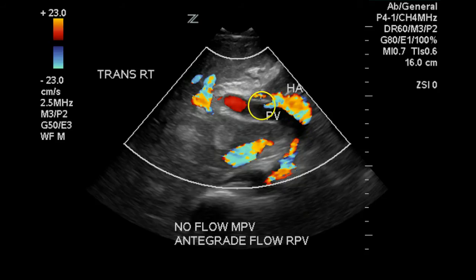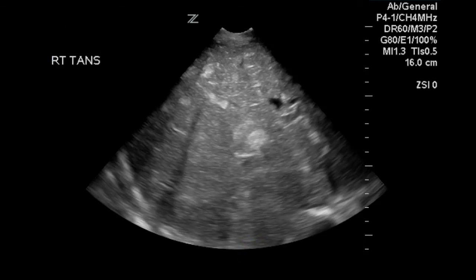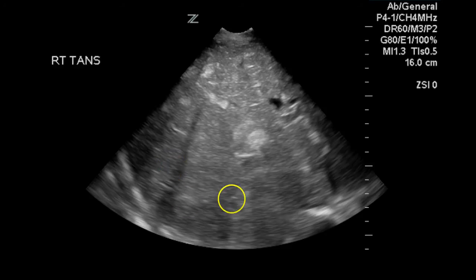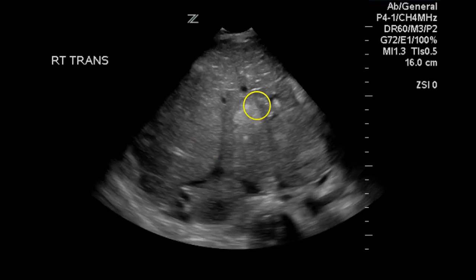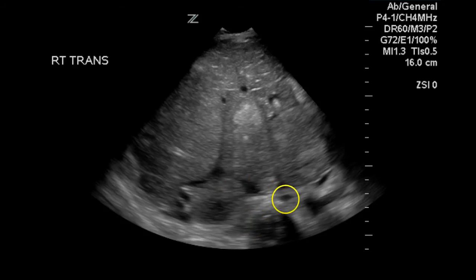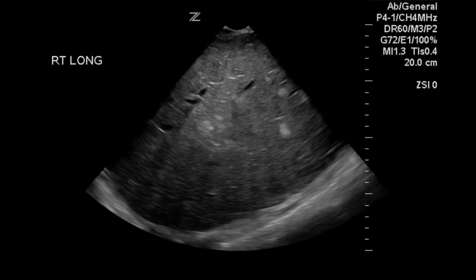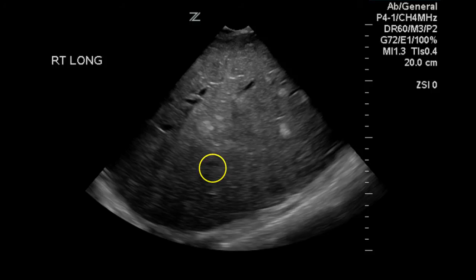Here is the main portal vein — we can see thrombus in this vessel. Here is the transverse view of the liver with a few of the echogenic solid nodules visualized, some more solid nodules, and some free fluid around the liver. The long axis of the liver shows more nodules, including some hypoechoic areas that also appear to be solid.